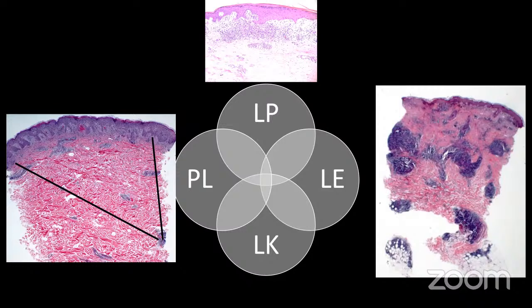They also have different ways they can present in the dermis. Lichen planus tends to be very band-like and restricted to the area underneath the epidermis, whereas pityriasis lichenoides, in addition to this interface reaction that, again, does not wipe out the rete and usually just obscures the junction, tends to involve the vascular plexus. So you'll have this wedge shape, especially when you draw a line like this, right?